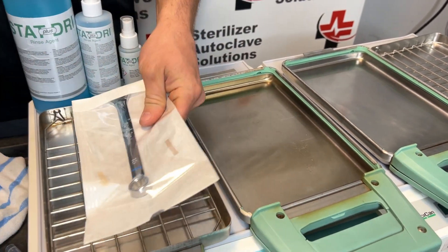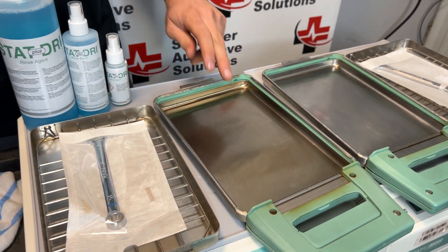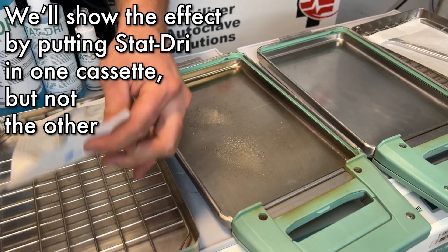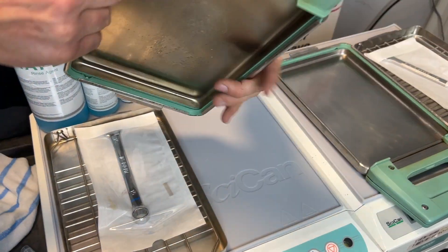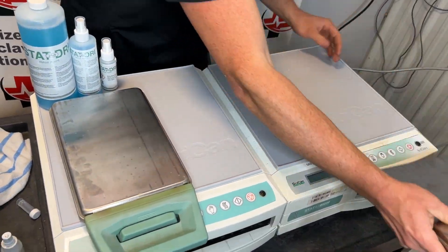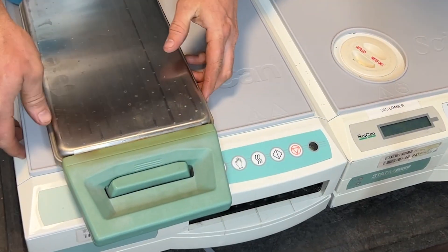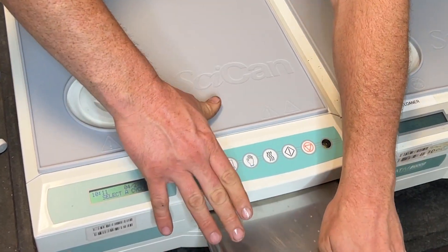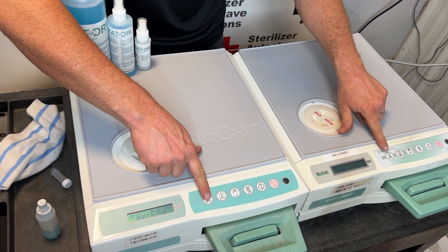I'm going to put a pouch in each one of these cassettes. This one, I'm going to spray STAT DRY in. And this one, we are not going to. Both these units are leveled at the same height, and we're going to run the same cycle on each.